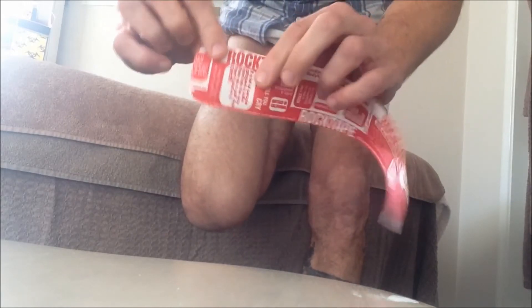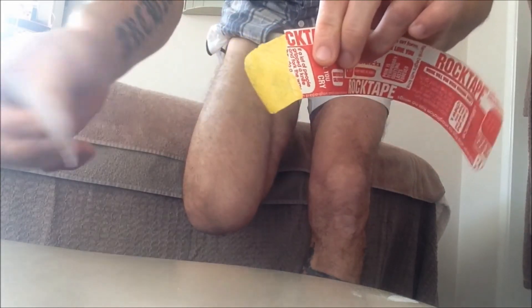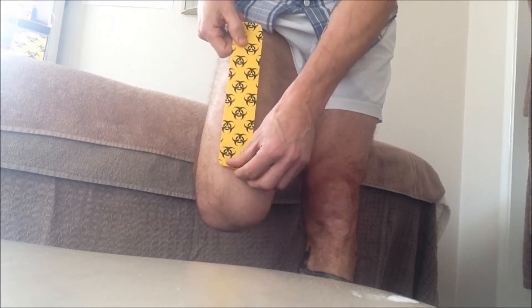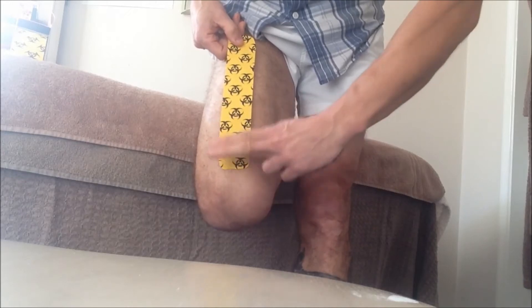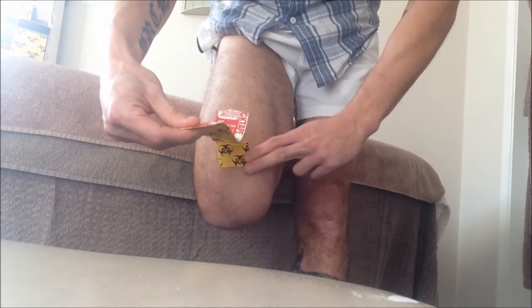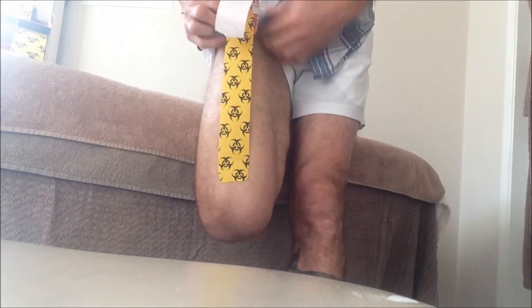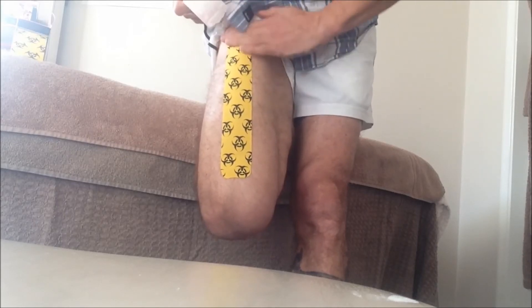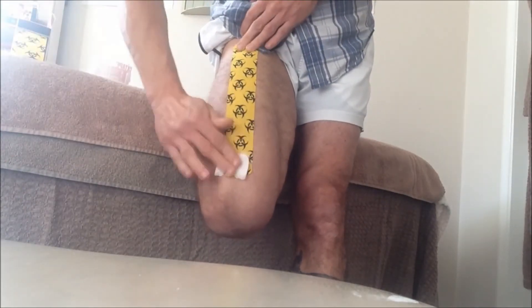In this position we apply our first piece. To apply it, we take the tape and rip about an inch of the backing off. Then we place this first piece down towards the quadriceps tendon and lay it flat with no stretch at all. With two fingers on the bit we've just stuck, if you pull the tape the backing will lift off — grasp at the end and lay this first piece with little to no stretch up the front of the leg, following the path of the muscle. Then using the printed side of the backing, we can just heat-activate the glue.